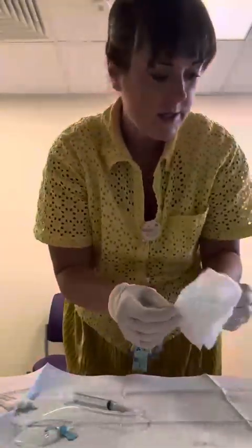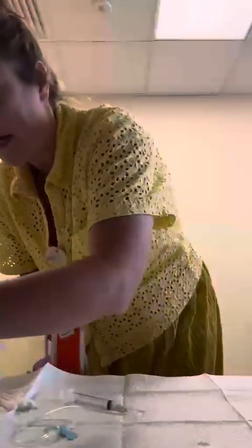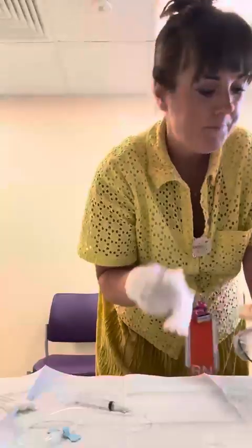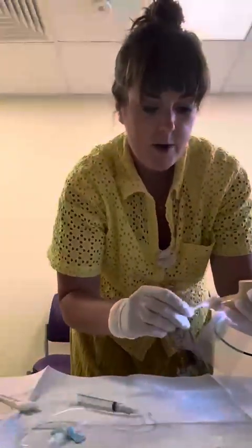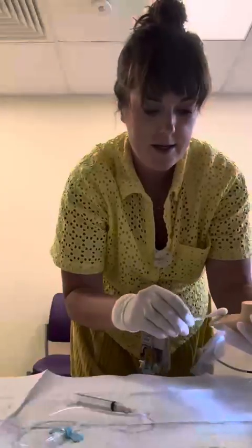So the next part is to grab all the things and try to be as sterile as possible. So I've got this fun little baby I'm going to pretend is the baby here. And then I'm going to get my transilluminator. We're going to get that in position using my gauze. Oh, these veins look so nice. Okay, so we're going to clean with my alcohol. You're going to use 3 different sticks.